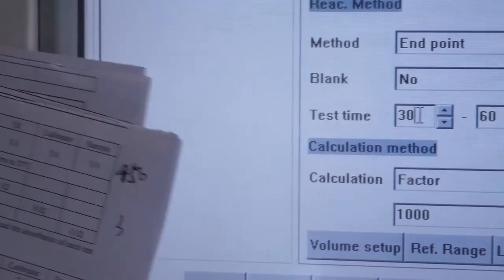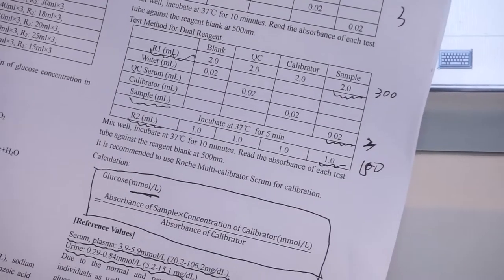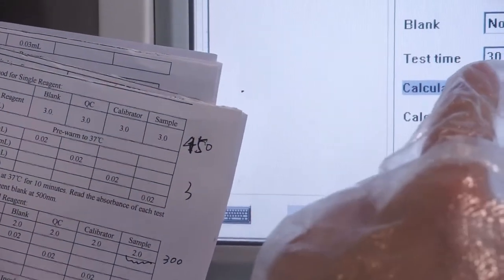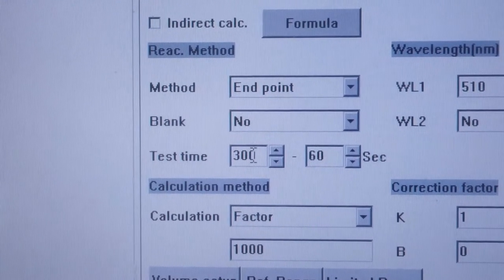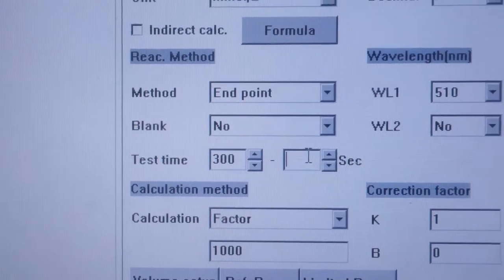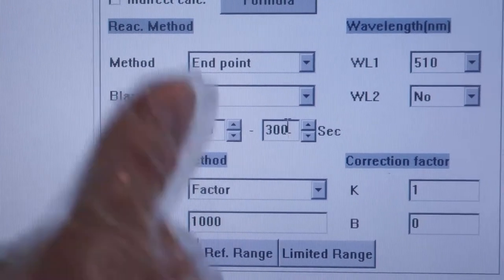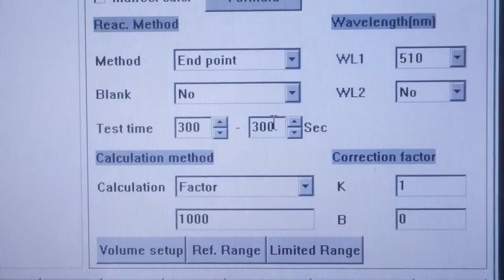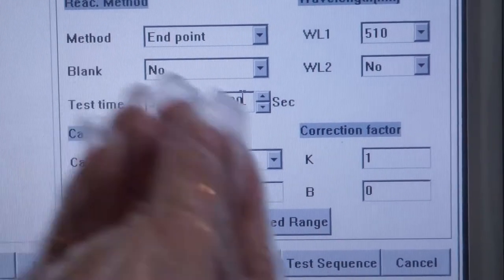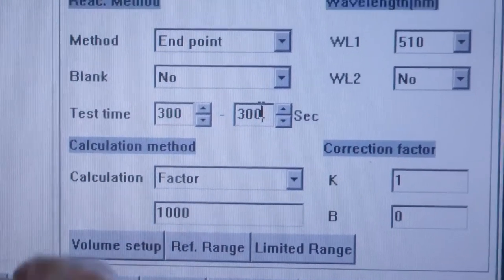And for the test time, because for glucose, also for the endpoint, we just test one absorbance, so we should make the test time the same. This one is the incubation time, and this one is the test time. So we input the test time, which is 300 seconds, for the test time and incubation time. And keep the two the same, it's okay. For the endpoint, we should keep the two the same. For all the items, if you use the endpoint, we keep the incubation time and test time the same, it's okay.